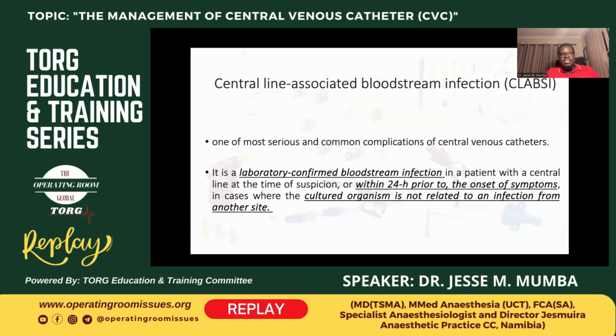By definition, I've highlighted a couple of important points for you to make this diagnosis. This being the most serious complication of central line, because if it's not recognized, it may lead to sepsis, and sepsis unrecognized is almost a death sentence. So we need to be able to recognize this serious complication.